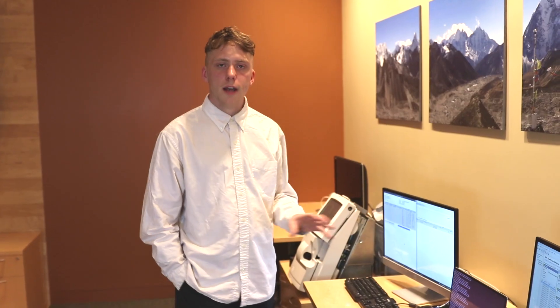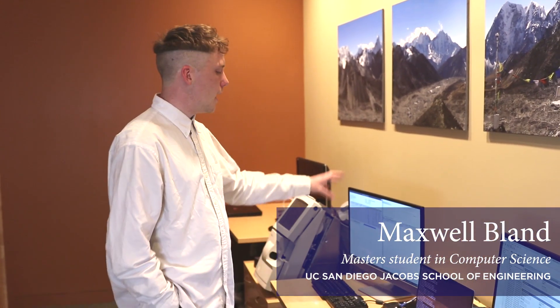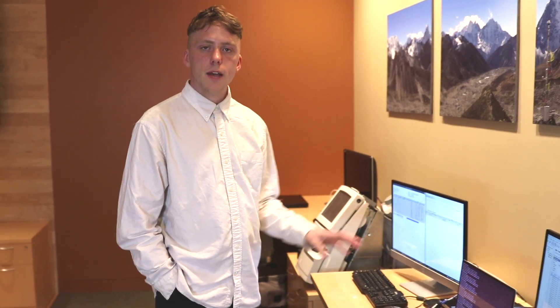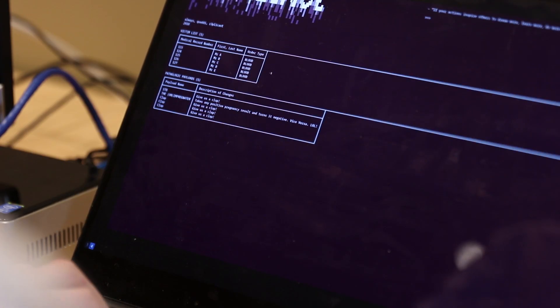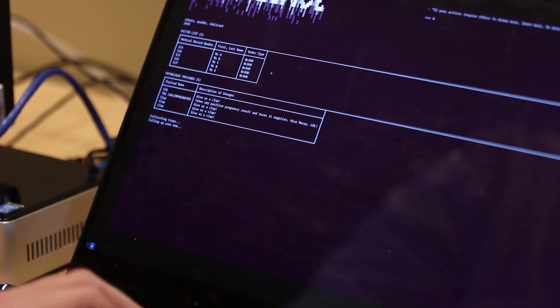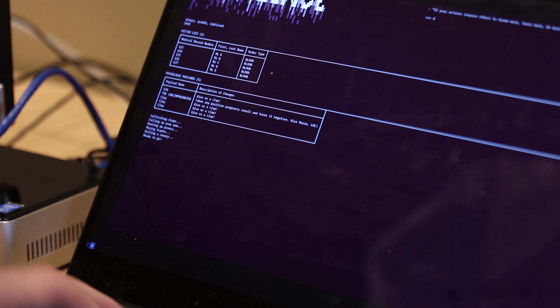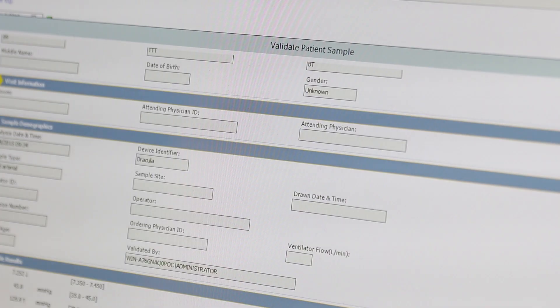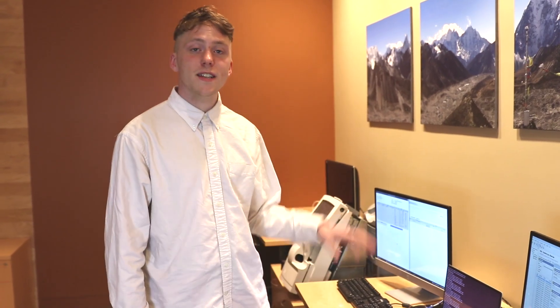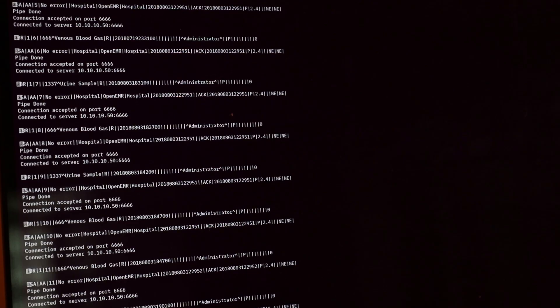As you can see here, this is where our attack comes into place. The attack takes place in the communication between the lab information system and the health information system. The attacking computer is going to perform what is called a man-in-the-middle attack. It will pretend to be the medical record system and tell the lab information system, 'hey, I'm over here, you can talk to me.' The lab information system will then send all the patient results from the blood gas machine to the attacking computer rather than the medical record system.